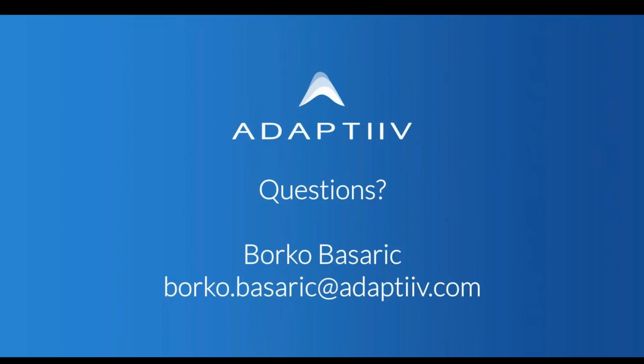So Borko. Yeah, hello. Thanks for the question. And the easy answer is yes. Adaptiiv software can be used with any printer, as you would be producing STL files with our software.